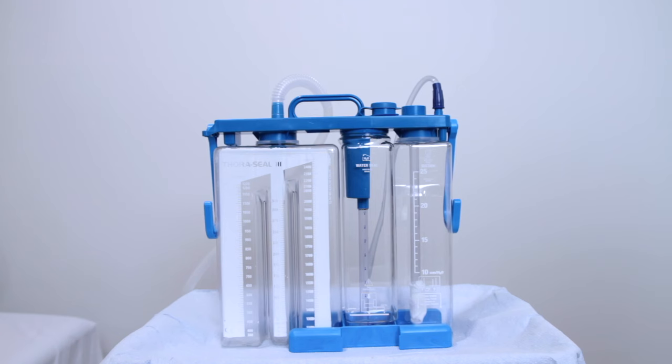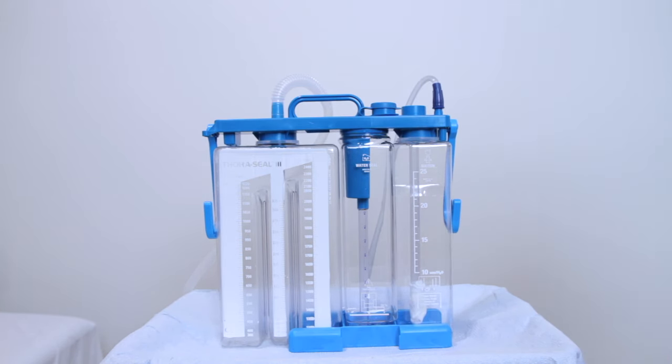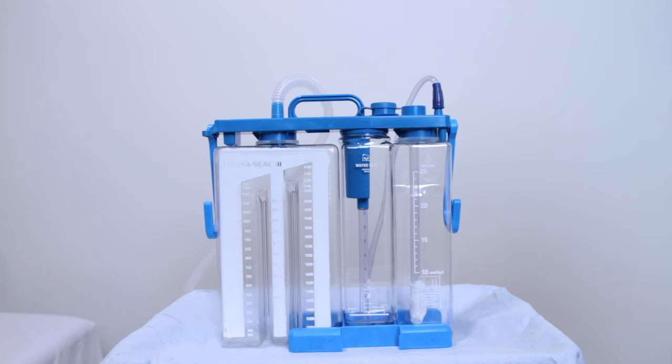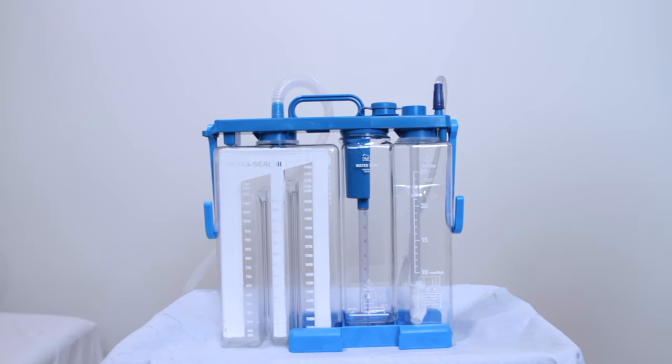The suction setup is the amount of vacuum that is prescribed by the ordering physician, as it will be specified in the order set. You will fill with sterile water from the top port shown here, filled to the desired level as prescribed — so it could be 15 centimeters, 20 centimeters, or 25 centimeters of suction. This is the port that you attach to the suction line. You should observe gentle bubbling, and the opening at the top of the suction chamber should not be occluded.